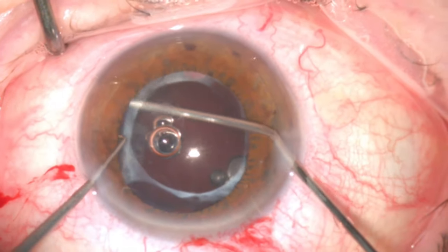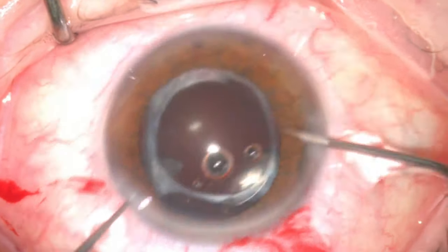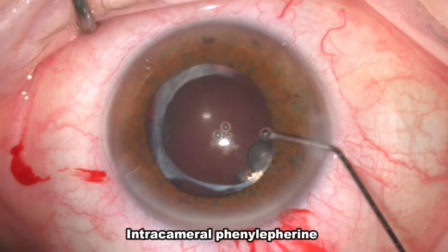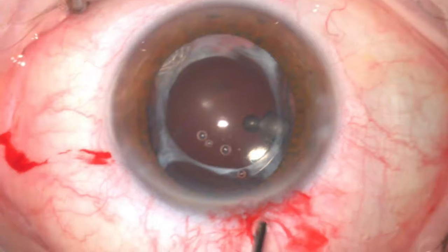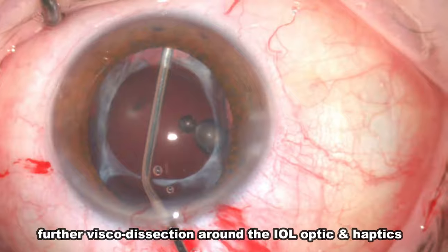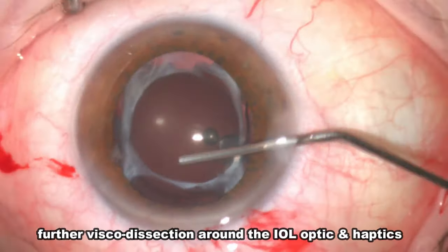The visco-elastic wave was clearly seen at this stage, which also confirms that the posterior capsule is intact. As the pupil was getting smaller, I injected intracameral diluted phenylephrine to dilate the pupil. Then visco-dissection was repeated again from the main incision and side ports before preparing the lens for explantation.